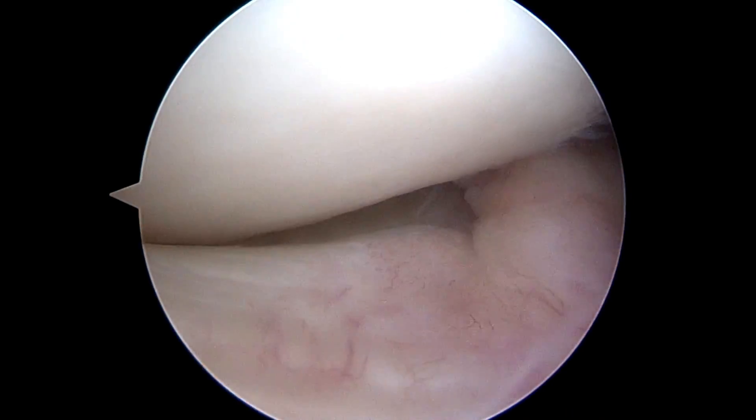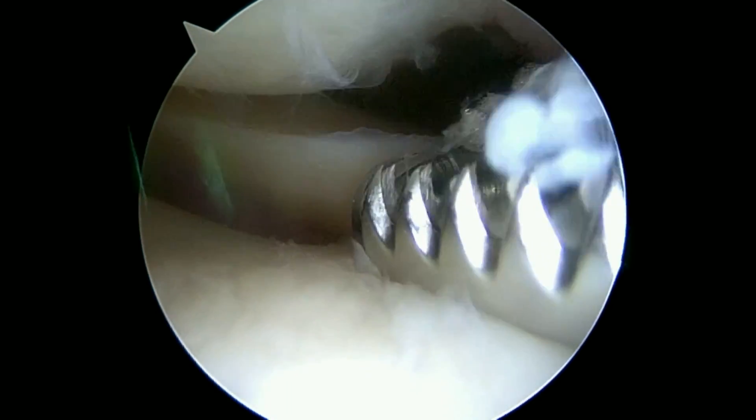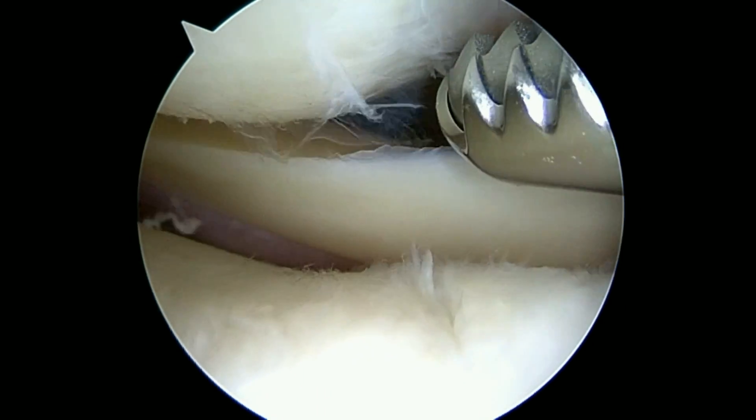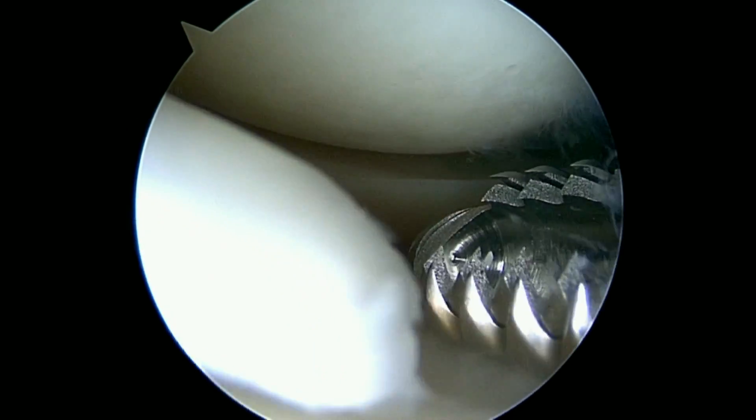Next we're going to look in the lateral compartment. The lateral meniscus is not in that bad a shape. There's one of the loose pieces we were worried about — you can see it right there. If it's soft enough, the shaver will take it away on its own, and that looks like what's happening here.